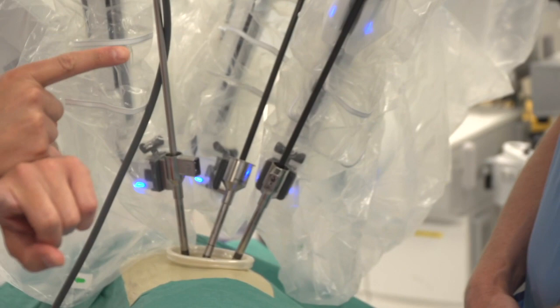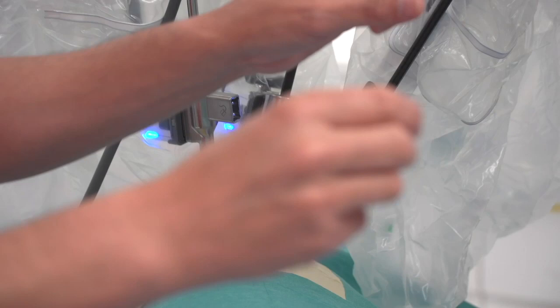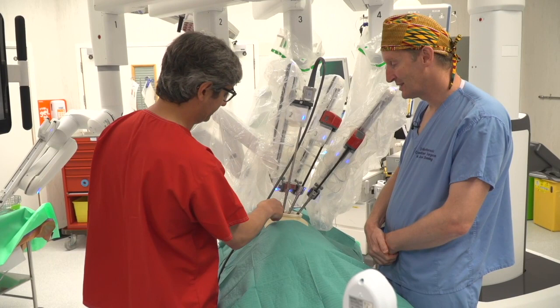So this is the left hand and this is the right hand, and we have to move everything at the same time. We always compare this to driving a car at the console. If you have some difficulties, you just rotate and then you go like this and you solve the difficulties. So it's working all together, looking for the target place where you want to work.